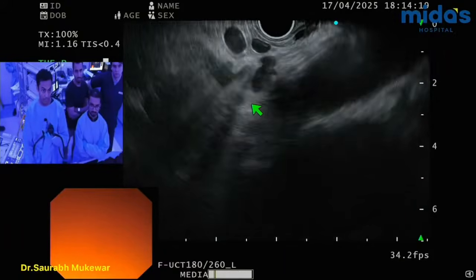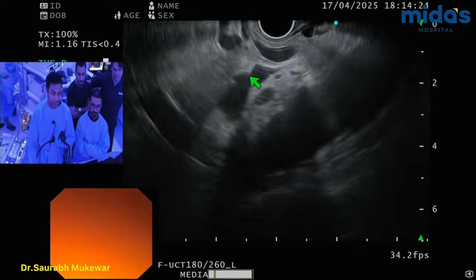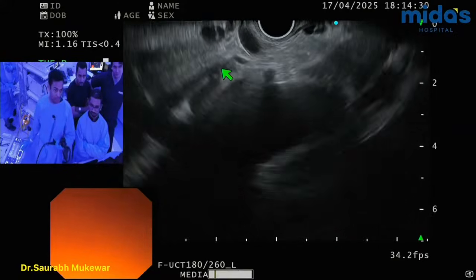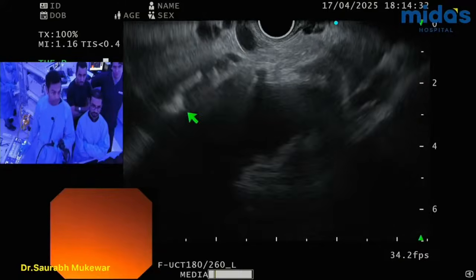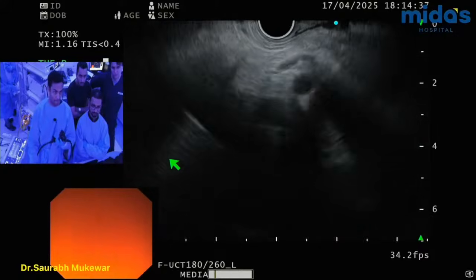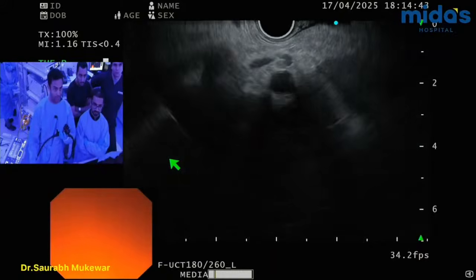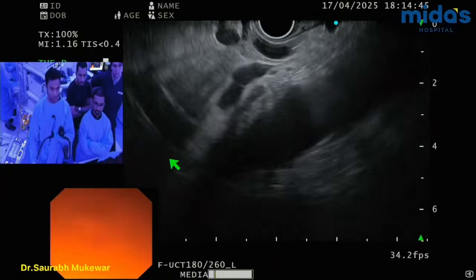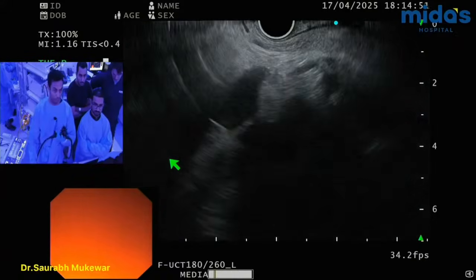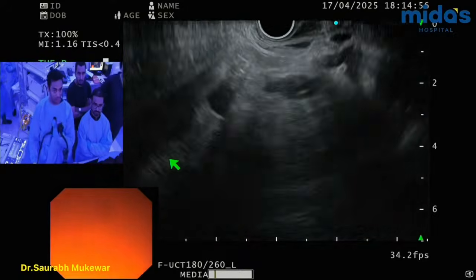going there, comes up, goes here, turns around. Yep, that's right. And then it goes down here, and then it continues on to the structure down here, which is the left kidney. Can't see that very well, but that's the left kidney down there. Trace. Yeah, okay, well, here it is. Here is, yep, the left kidney right there.